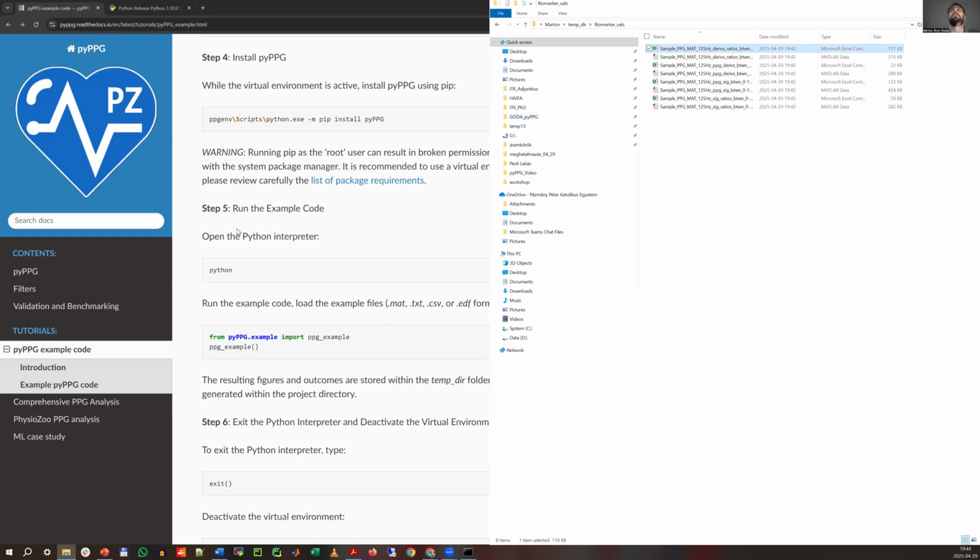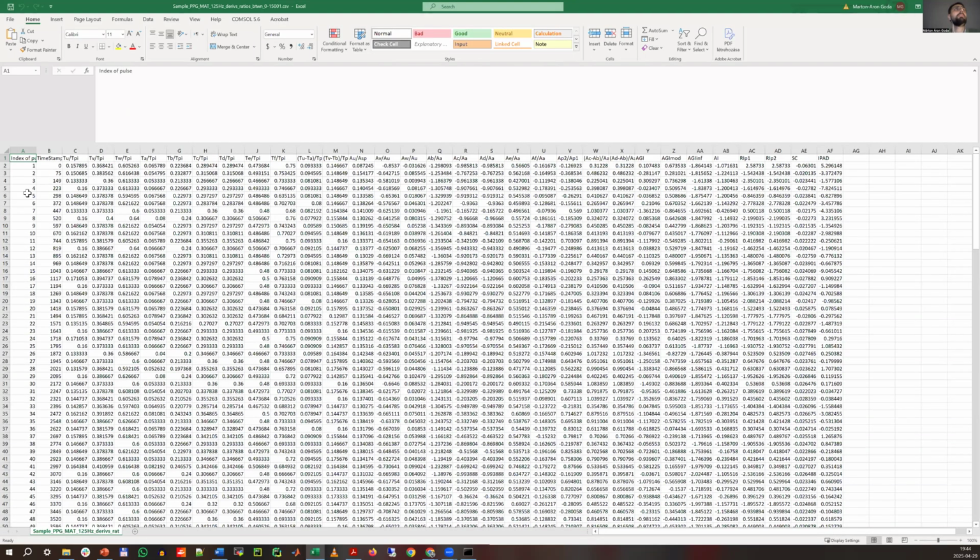Here you can see the results of the biomarkers for each pulse wave. So it's the first, second, and so on. And what is important is that we have four types of biomarkers. If you dive a little bit into the details in the documentation, you're going to see that we use the biomarkers for the original PPG signal. There are some ratios and modified calculations.